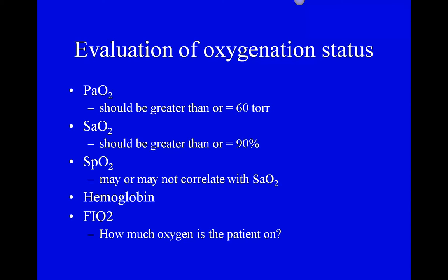80% oxygen would be recorded 0.80. 100% oxygen, if I took 100 divided by 100, I'd have 1. So fraction of inspired oxygen versus the percentage of inspired oxygen, it tells you how much oxygen the patient's on.